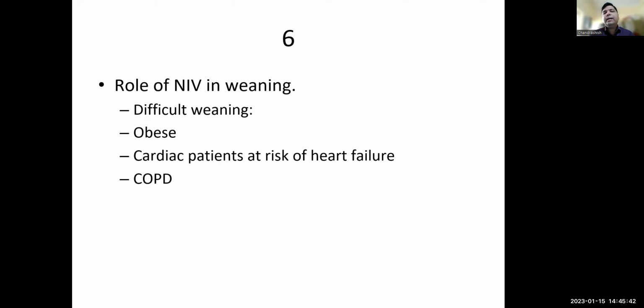And the reason is because these patients, because of the physiology, have a higher positive pleural pressure, they have a higher tendency to develop basal atelectasis, and non-invasive ventilation, particularly CPAP or a higher EPAP, is going to prevent that. So in obese patients, there is good evidence that planned NIV, or transition from invasive ventilation to non-invasive, is going to be helpful.